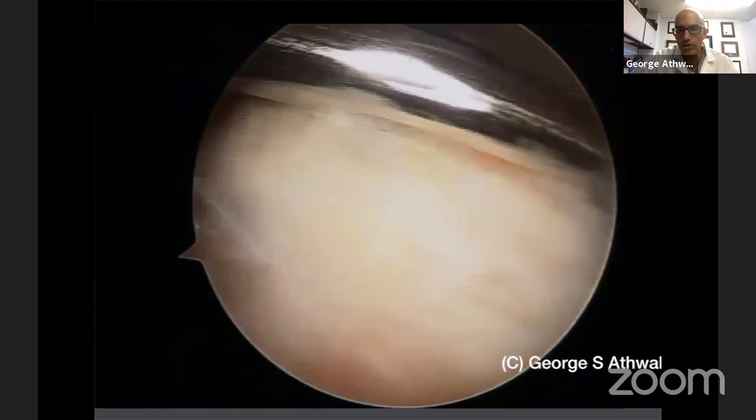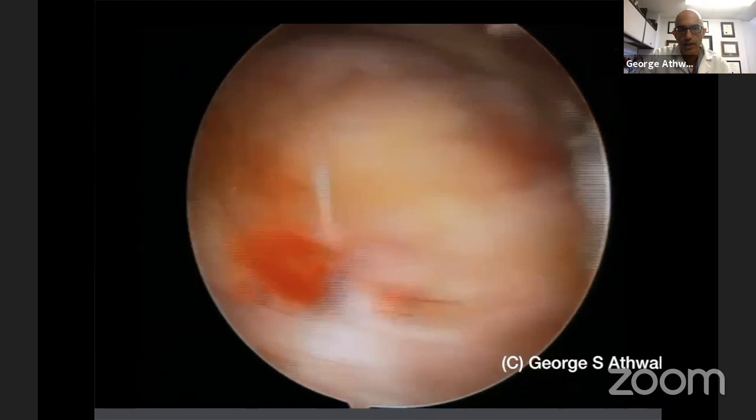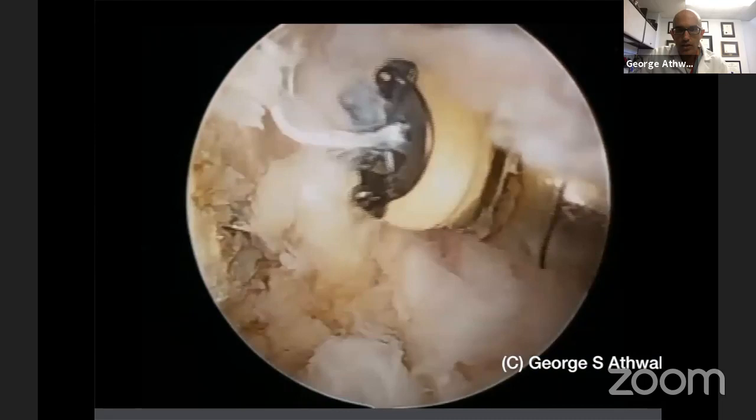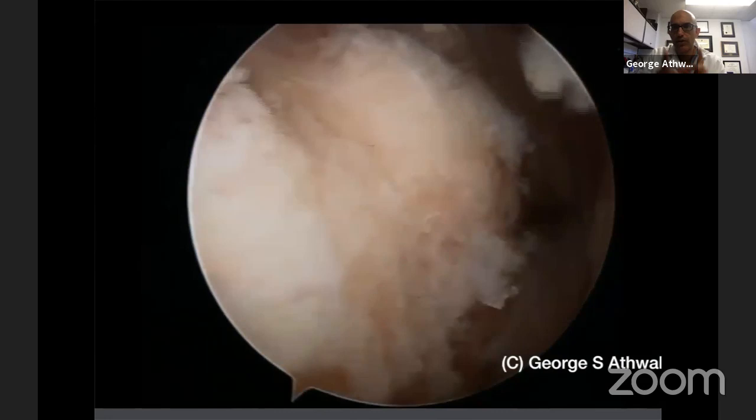This is an ACL guide pin. I'm gonna start along the posterior aspect of the humerus inside the footprint of the infraspinatus. And I'm aiming it for the biceps groove because that has the best quality bone for me to flip my cortical button. So here's the biceps groove. There's my guide pin going through the humerus from back to front. Now I'm going to pass this percutaneously out the front. So now I've got a guide pin going completely across the humerus.